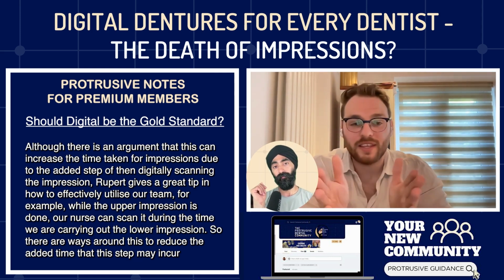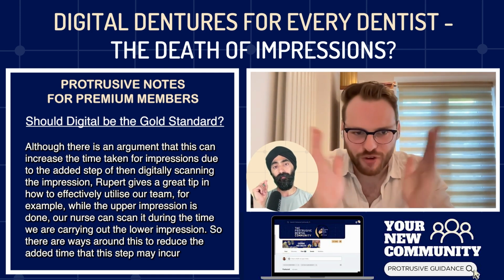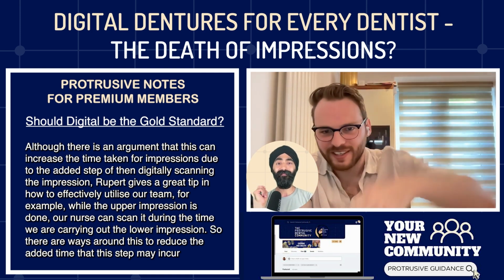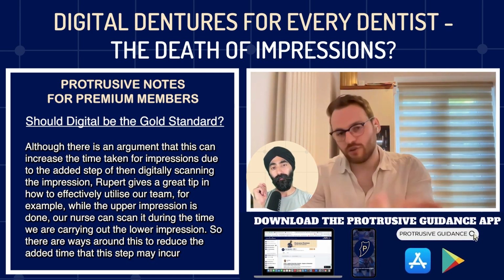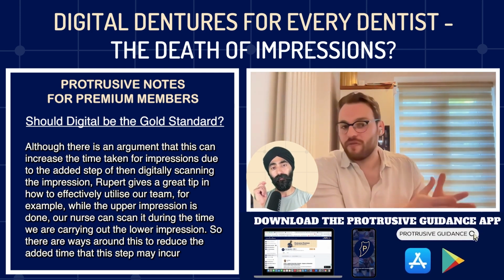Yeah, exactly. And that's it. You could say, well, I can shrink my turnaround time by 2 days because it's not going to take 2 days to get there. And the model's already cast up. They haven't got to sit there and wait for the stone to set and then trim it. And so there is a lot more efficiency from there.